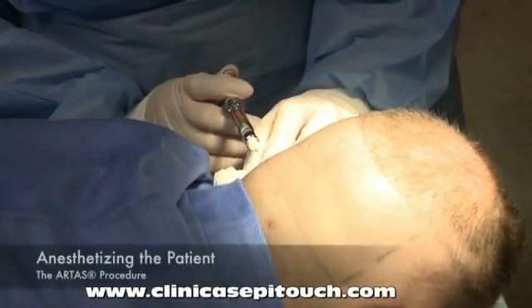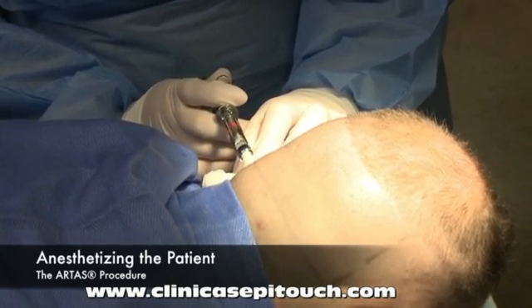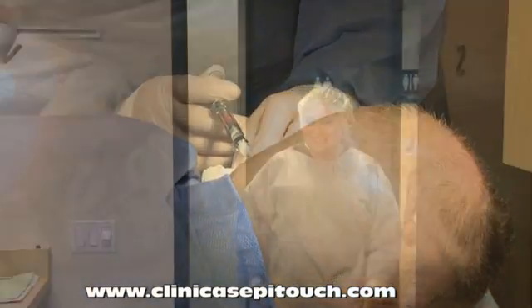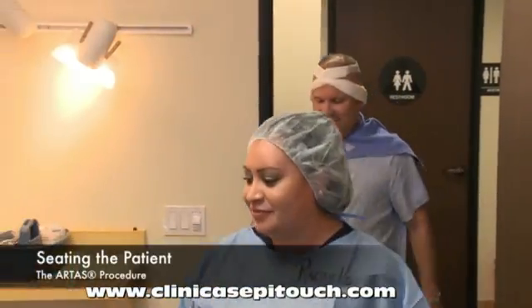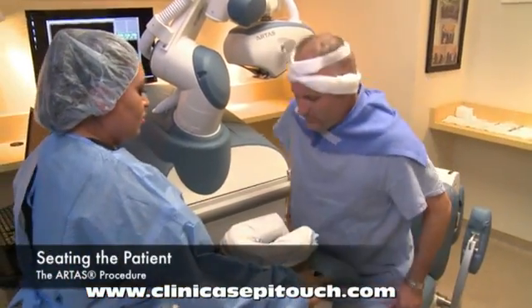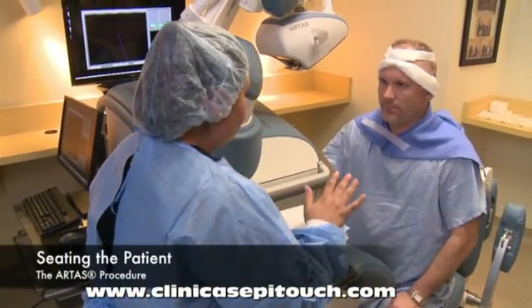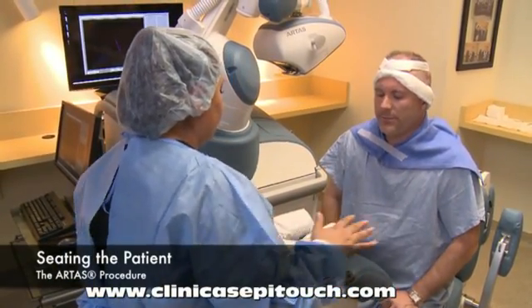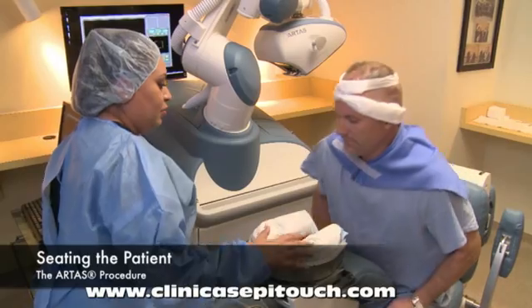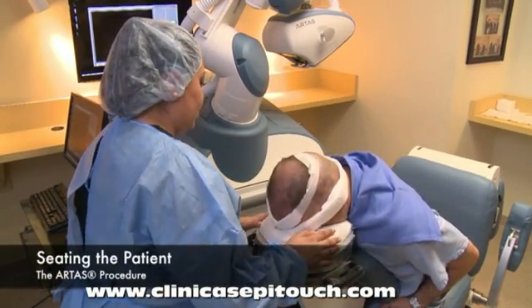Next, the donor area will be anesthetized. The patient will now be brought into the room with the ARTAS system and seated in this chair. This chair was designed for two purposes: first, to provide comfort for the patient throughout the case, and second, to position the patient's donor area in the optimal position for harvesting.